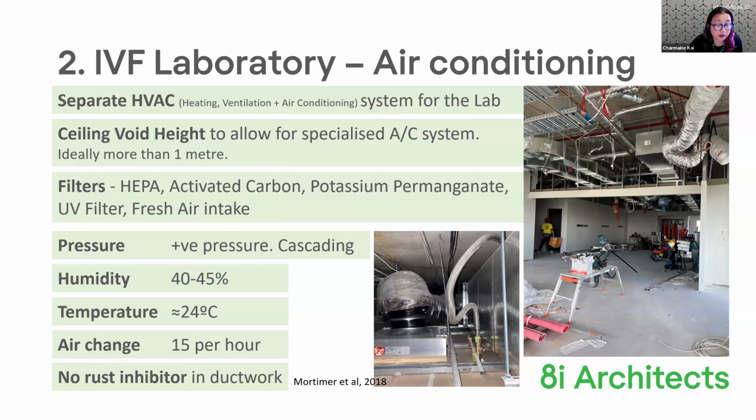What you want to stipulate very, very early on is that they do not put that in, as a lot of times the chemicals in rust inhibitors are actually embryotoxic. And because your air is blowing over the rust inhibitor, you will be pumping those chemicals into your space unknowingly. So something to really think about, particularly for those in countries where you do have high humidity, where it is standard practice to put in rust inhibitors.